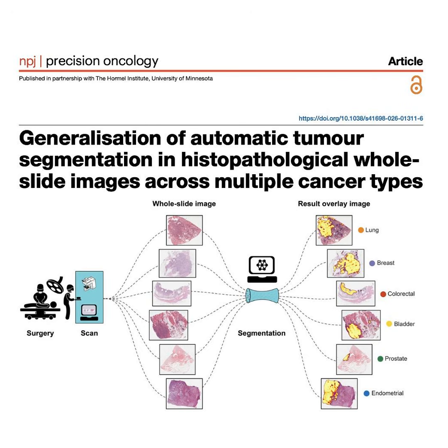Well, the researchers tested the AI against this exact variance using cohorts from external labs like the Cancer Genome Atlas. And how did it hold up? The result was amazing. The performance didn't drop at all. Really? Yeah, the model was incredibly robust to real-world technical variations in color profiles and scanner hardware. It also vastly outperformed a general medical foundation model called MedSAM.